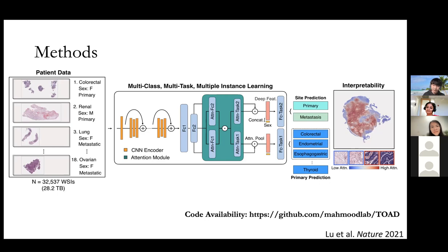So in essence, how we can further improve performance for certain tasks in this field, I think it's going to have to come from both the learning algorithms that come after the representation learning, but also the representation learning and the problem formulation itself. So it's really like a two-stage approach. At least that's what it looks like is where the field is headed.